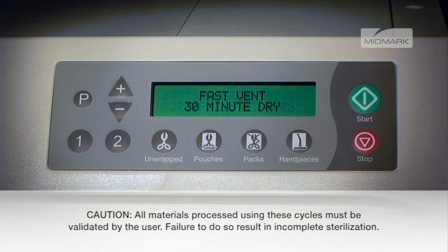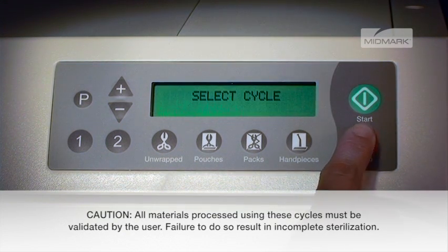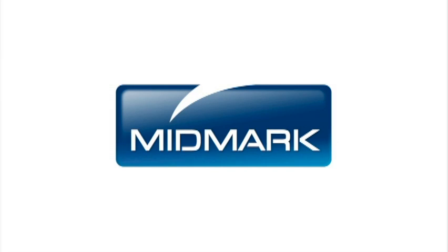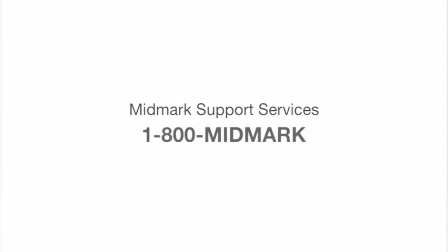Pressing the stop button any time during the programming procedure will cancel the changes and revert to the original settings. For more detailed information about maintaining your autoclave, please refer to the M9-M11 installation and operation manual. For further support, contact Midmark Support Services at 1-800-MIDMARK.